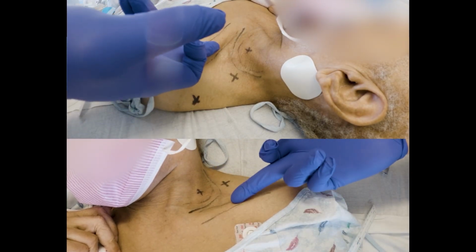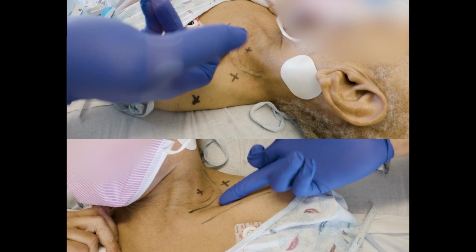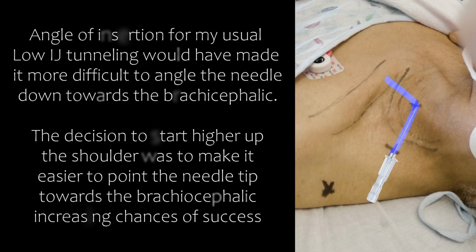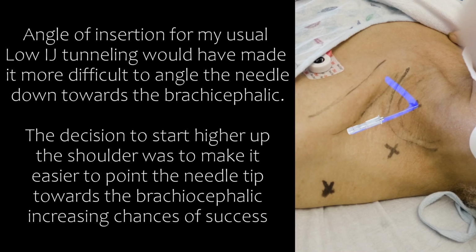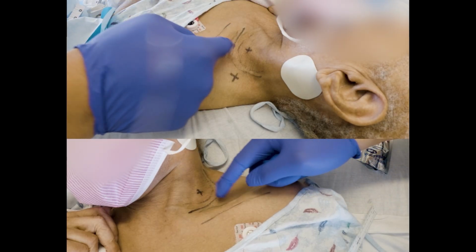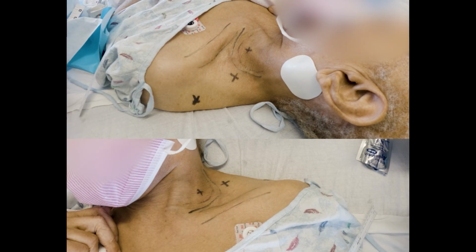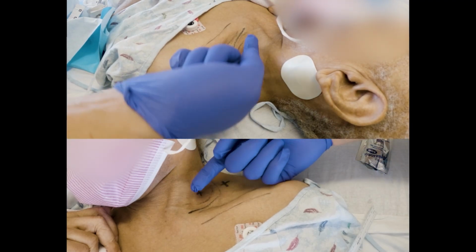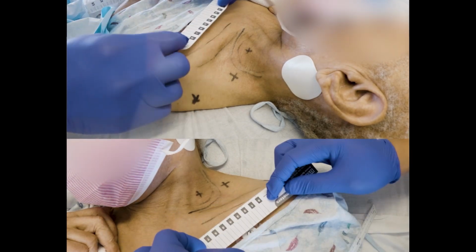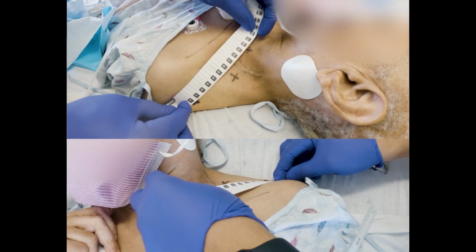And I'm going to have a very hard time inserting from down here low because of the clavicle and the EJ. So we're going to have to go from here, tap it this way, and then tunnel it out to a safe exit site.